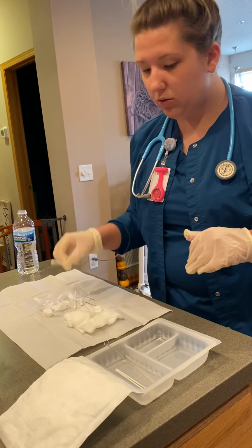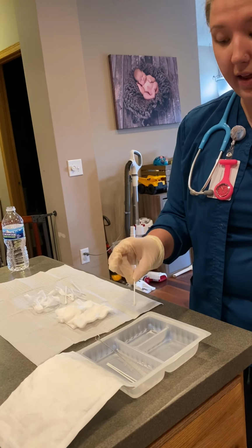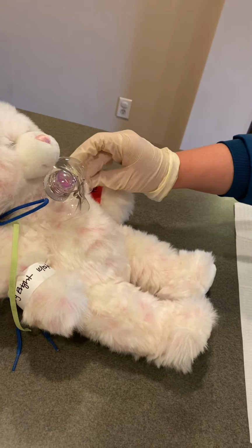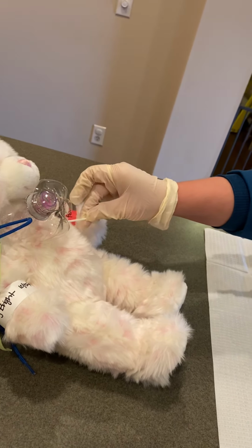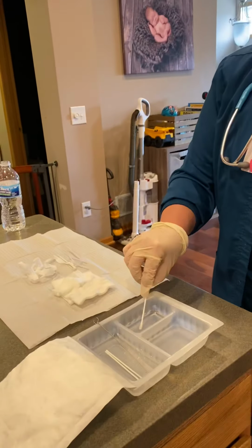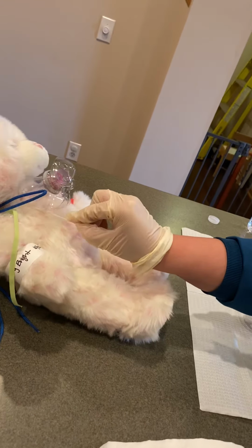And so I have these Q-tips, and I'm gonna use my last compartment here. I'm going to moisten it in the saline, and I'm going to clean as best as I can around the trach site, and then discard. And then I'm also gonna grab another one here and do the other side. I could use as many as I would need to ensure that the site was clean, but then I'm going to clean on that side as well.